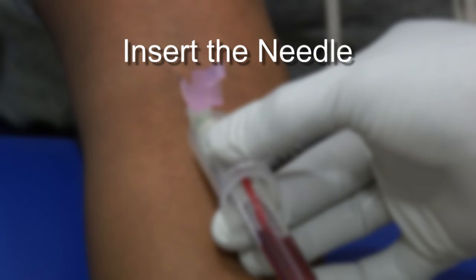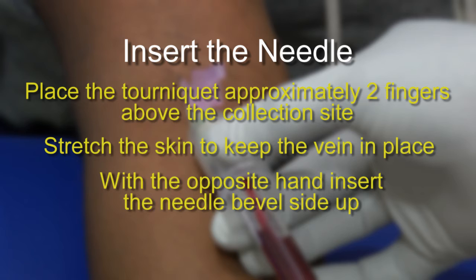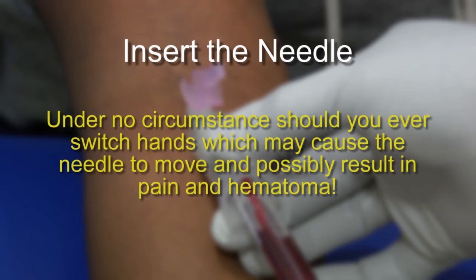Insert the needle. Place the tourniquet. Stretch the skin to keep the vein in place. Use the opposite hand to insert the needle bevel up. Under no circumstances should you ever switch hands. This can cause the needle to move around in the patient's arm and can also cause pain and hematoma.